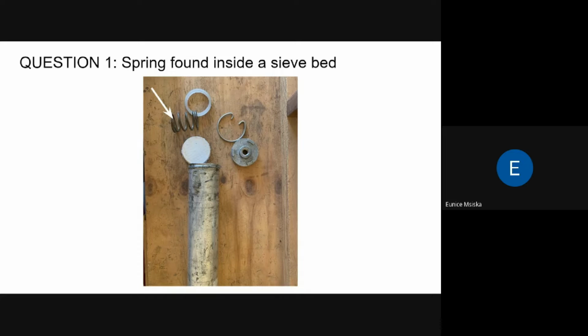So to answer your question, the spring helps to compact the zeolite and also hold the zeolite in place so that the zeolite doesn't move around during the pressurization process. It is necessary to have the zeolite compacted and not moving about anyhow, as that would lead to a drop in purity. When the zeolite is not compacted, it leaves room for air along with nitrogen to pass through some open spaces, and hence some nitrogen will not be absorbed by zeolite. So this process will lead to a drop in your purity.